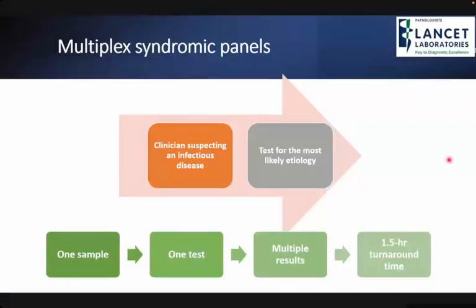So multiplex syndromic panels. So we love these, because it's difficult to tell whether the patient has Neisseria gonorrhoeae or Chlamydia trachomatis, or they have Trichomonas vaginalis.